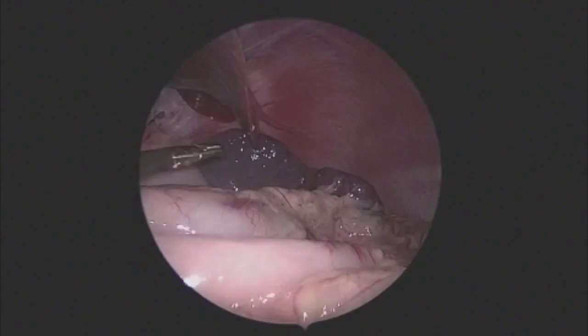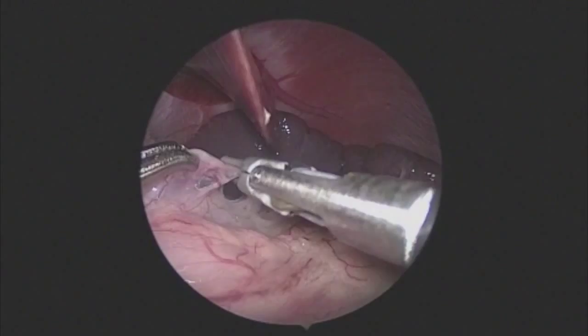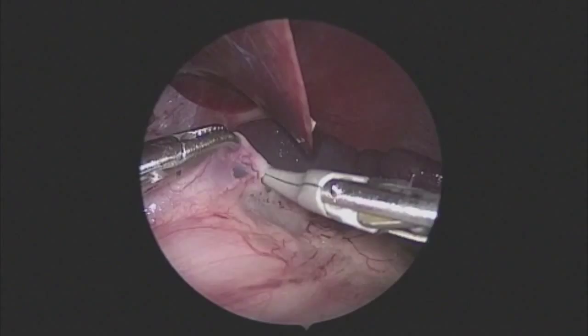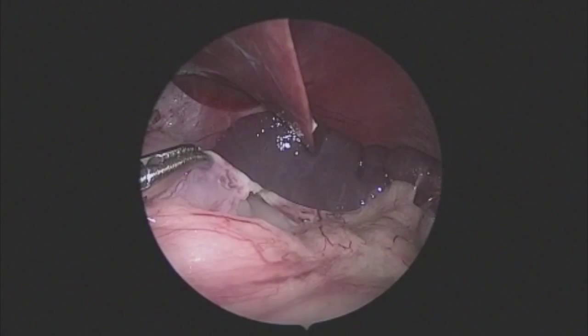The left upper quadrant port is then used to retract the stomach medially, exposing the short gastric vessels. This is an approximately one-year-old child weighing about 12 kilos. The short gastric vessels are being sealed using the sealer. The advantage of this technique is that both hands can be used to dissect out the vessels, and then safe seals can be made with limited spread of energy to the stomach.